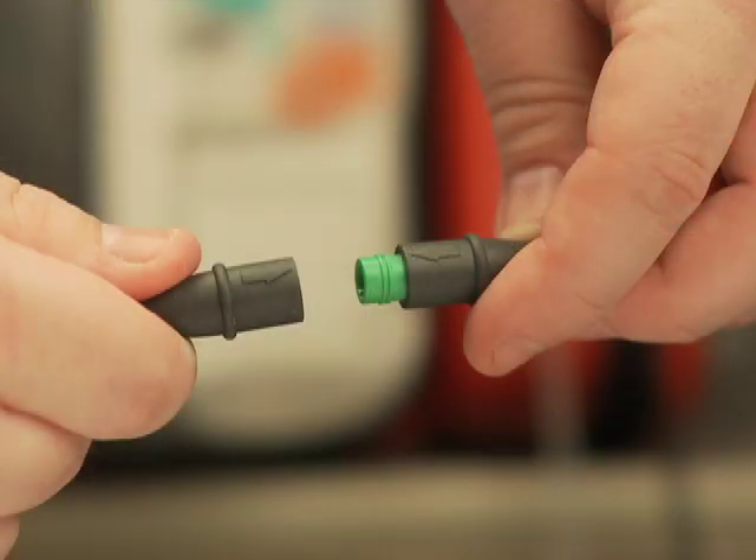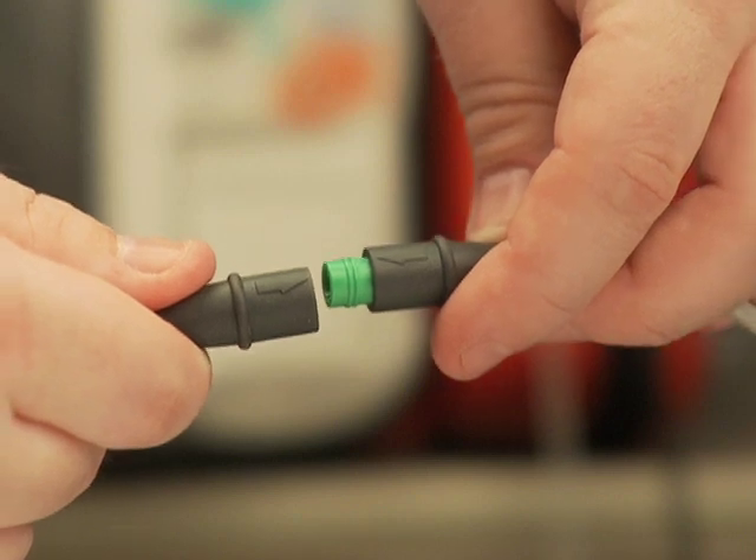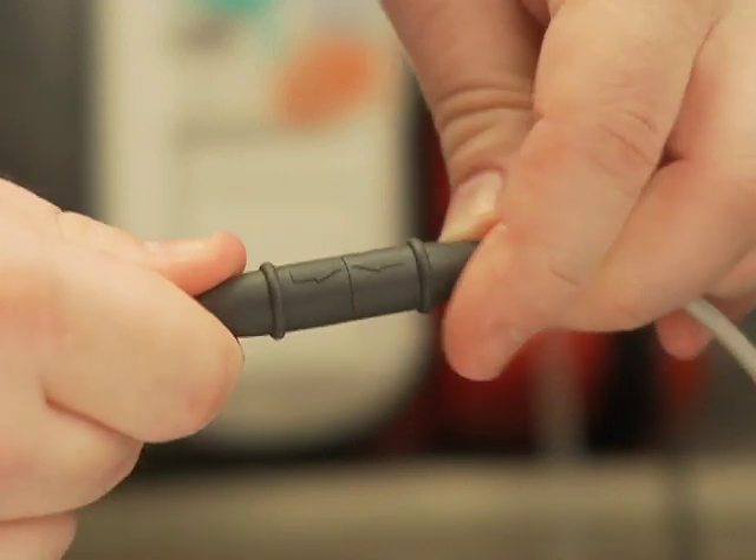To connect the CPR meter to the CPR cable, align the arrow marker on the CPR cable connector with the arrow marker on the meter's integrated cable. Push until it snaps into place.